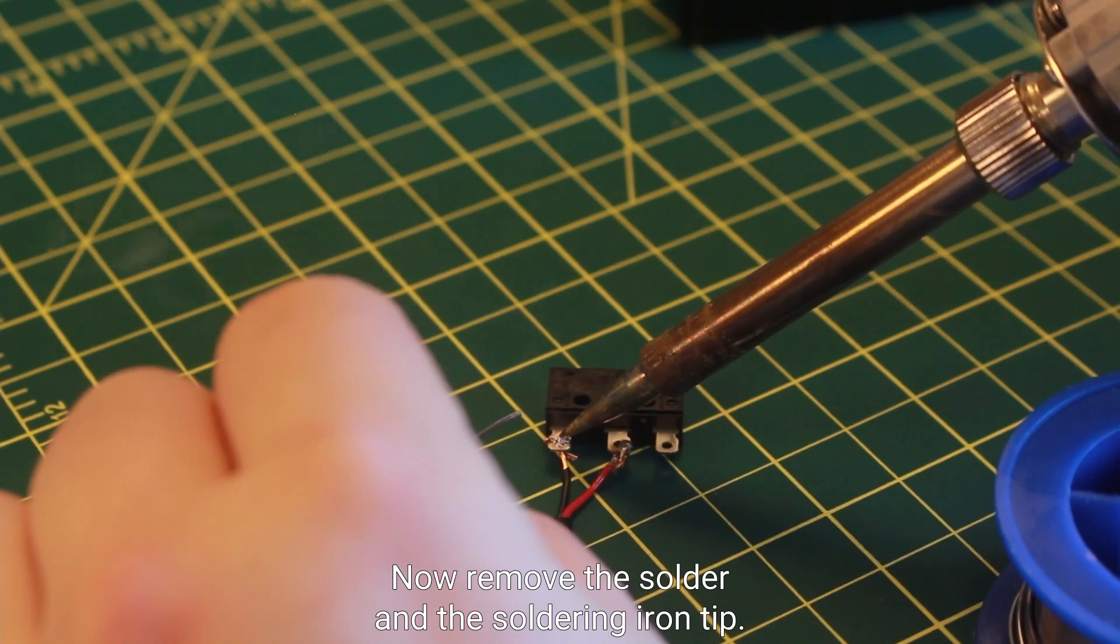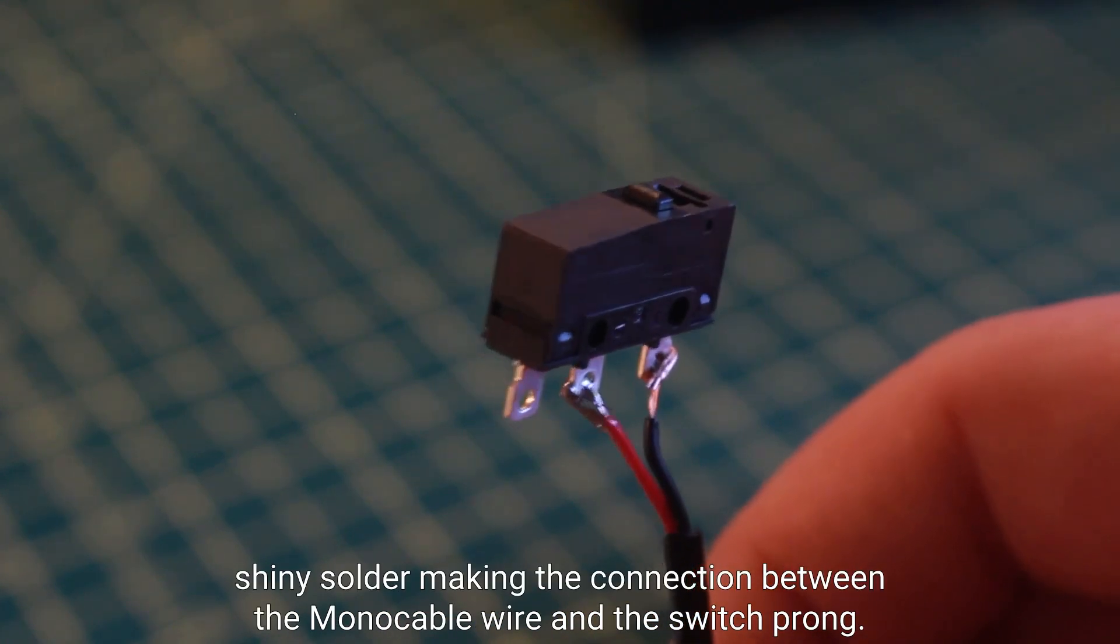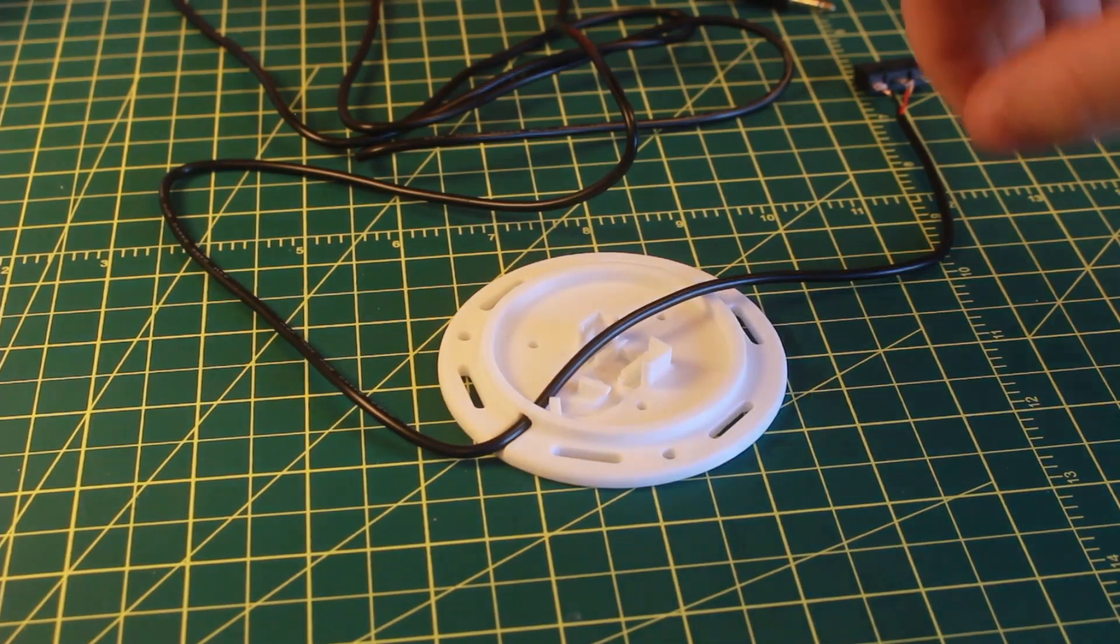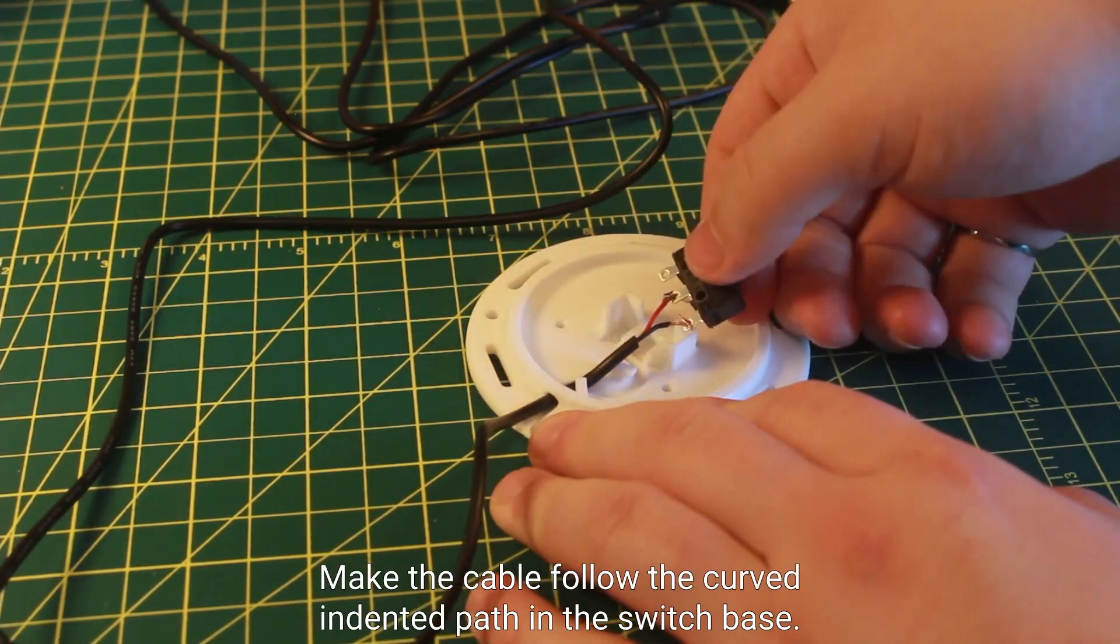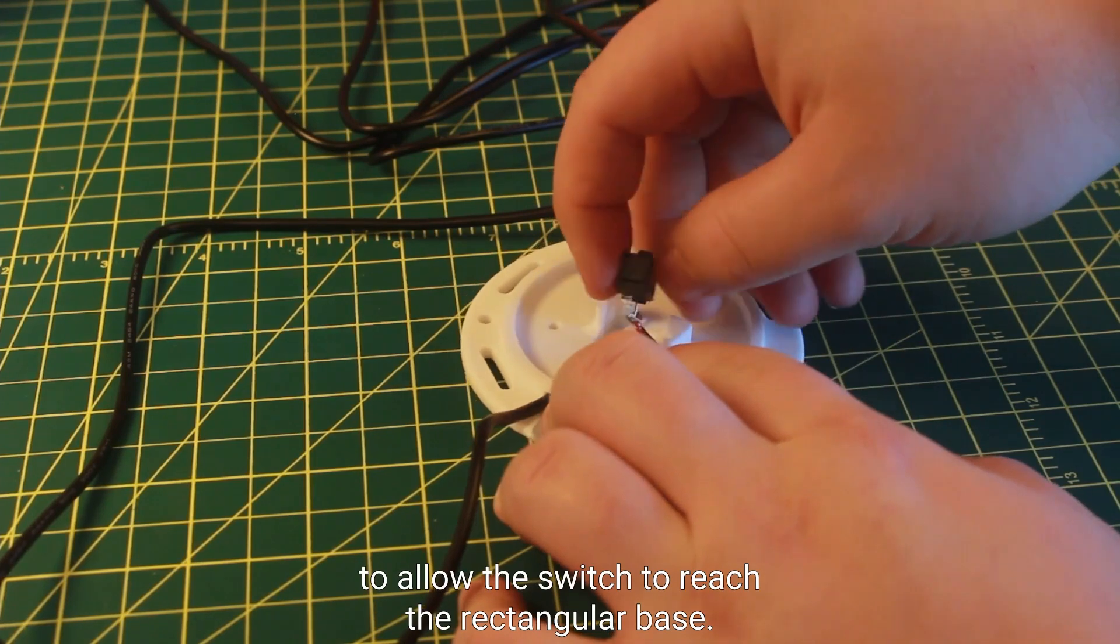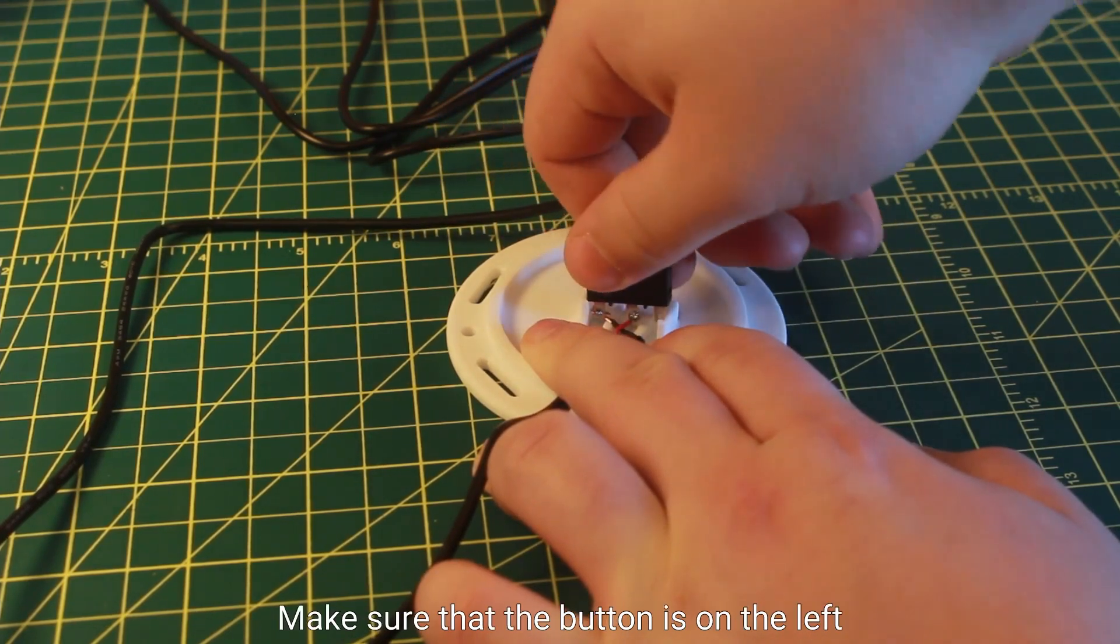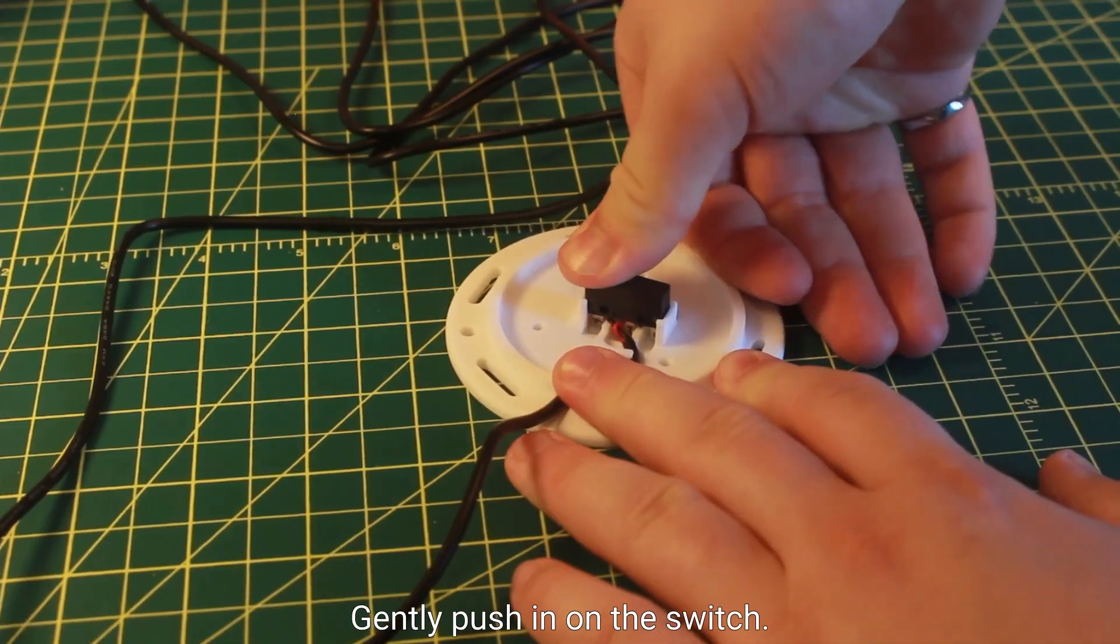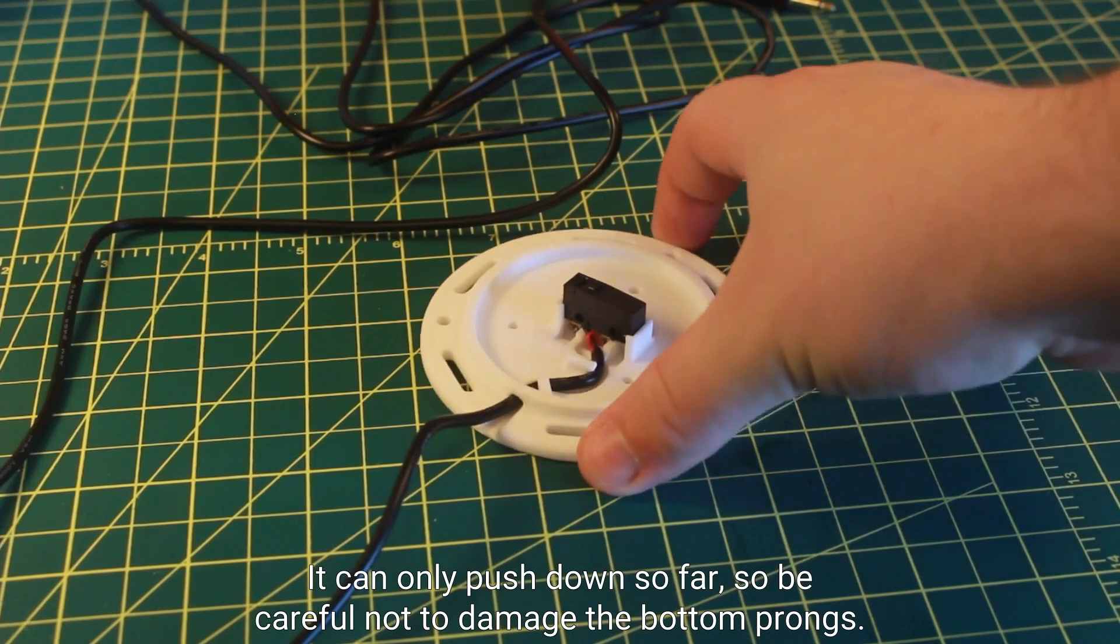Now remove the solder and the soldering iron tip. When completed you should see hardened shiny solder making the connection between the mono cable wire and the switch prong. We can now take the soldered switch and cable and feed it back through the hole of the switch base. Make the cable follow the curved indented path in the switch base. Do this until there is just enough cable to allow the switch to reach the rectangular base. Line up the switch with the rectangular slots pointed down. Make sure that the button is on the left side of the mono cable hole in the switch base. This can be seen here. Gently push in on the switch. The switch will not be flush with the rectangular piece. It can only push down so far, so be careful not to damage the bottom prongs.